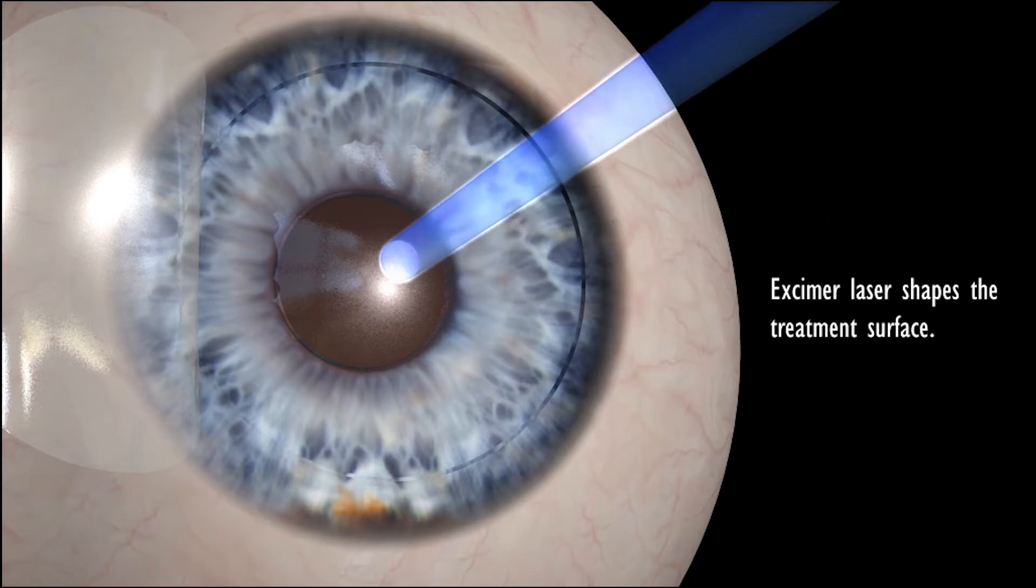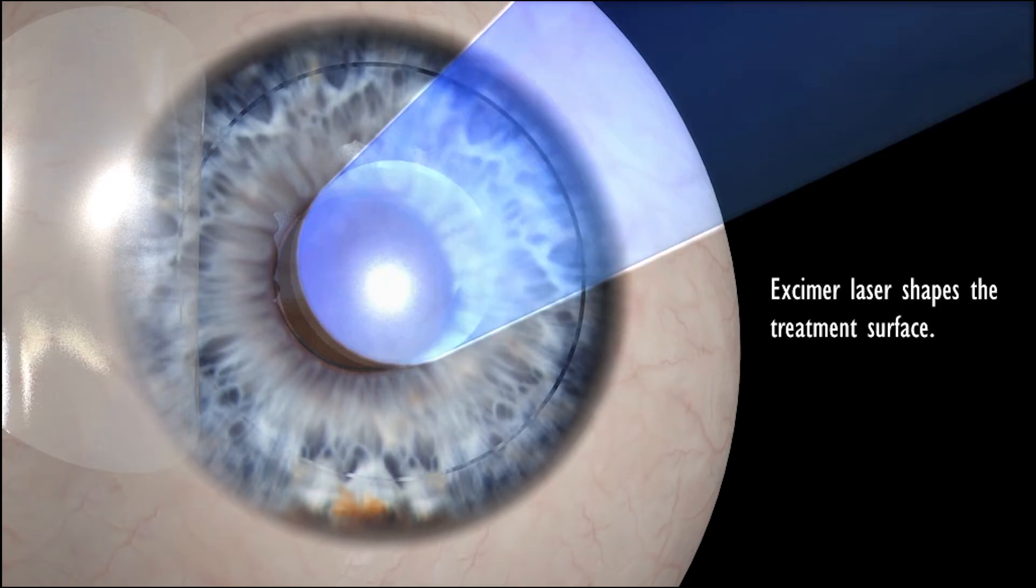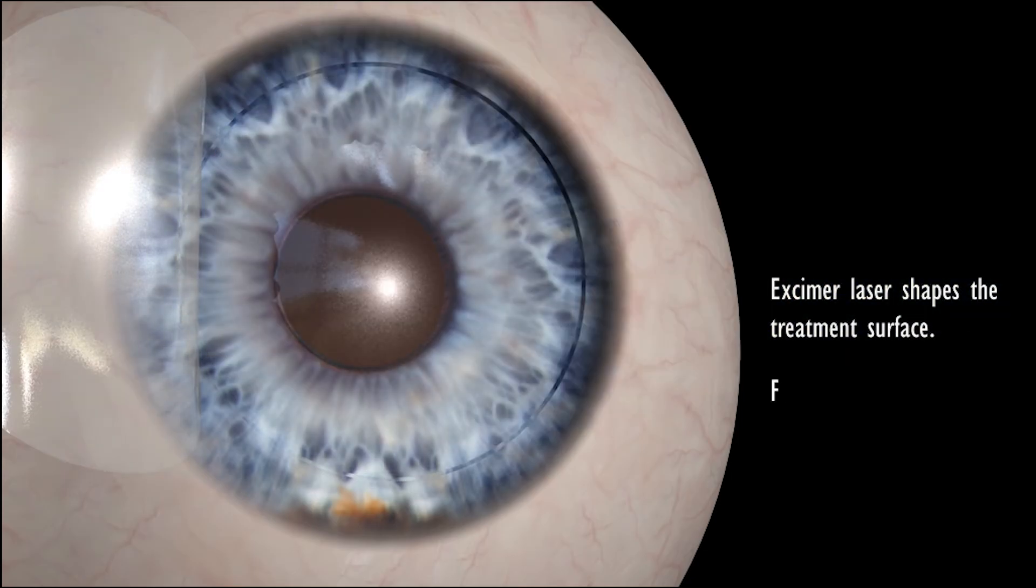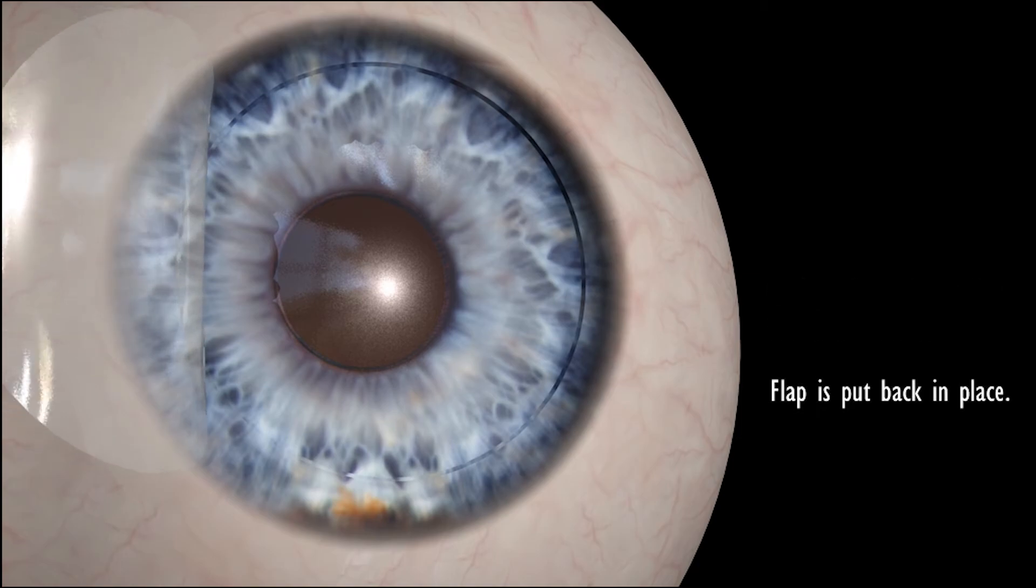Now a second laser, an excimer laser, performs the actual correction of the cornea. It reshapes the curvature of the cornea to the desired refraction.